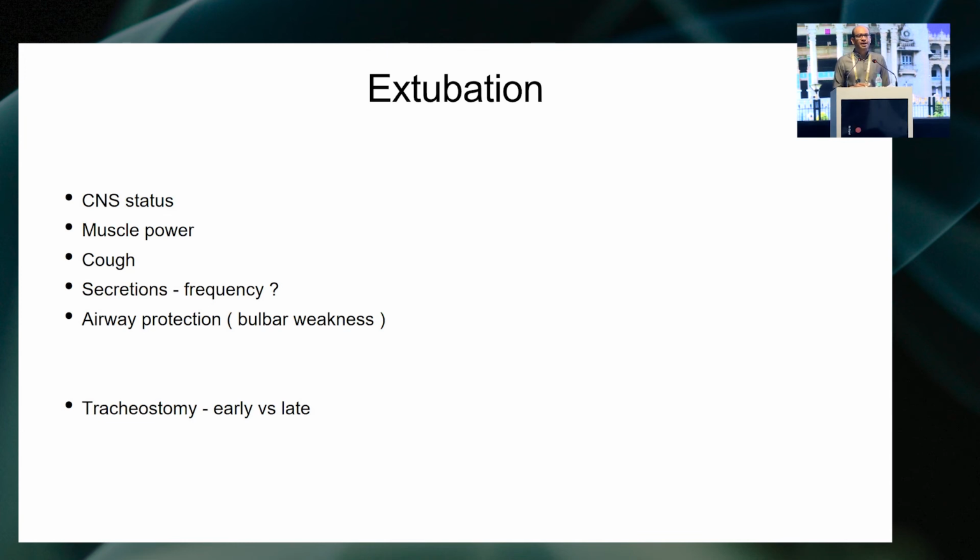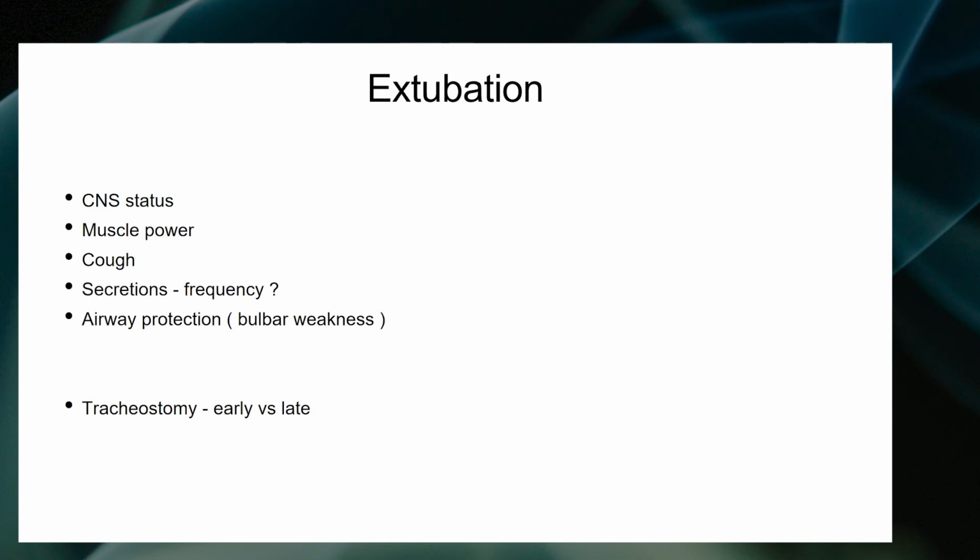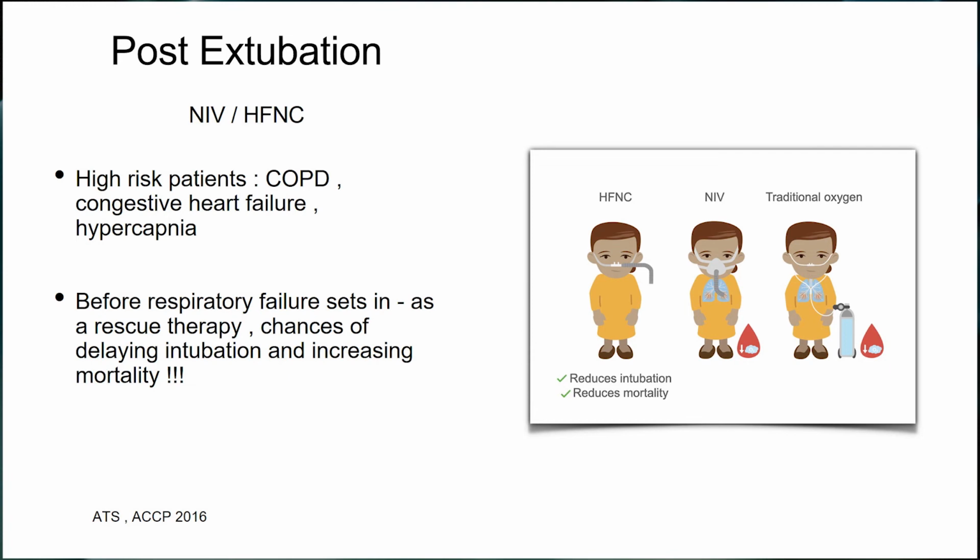Post-extubation, is there a role for high flow or NIV? Again, there is a good amount of data and guidelines recommend that in those subsets of patients where there is a high probability of post-extubation failure, such as patients with COPD, patients with hypercapnic respiratory failure, there seems to be a definitive role of giving NIV post-extubation.